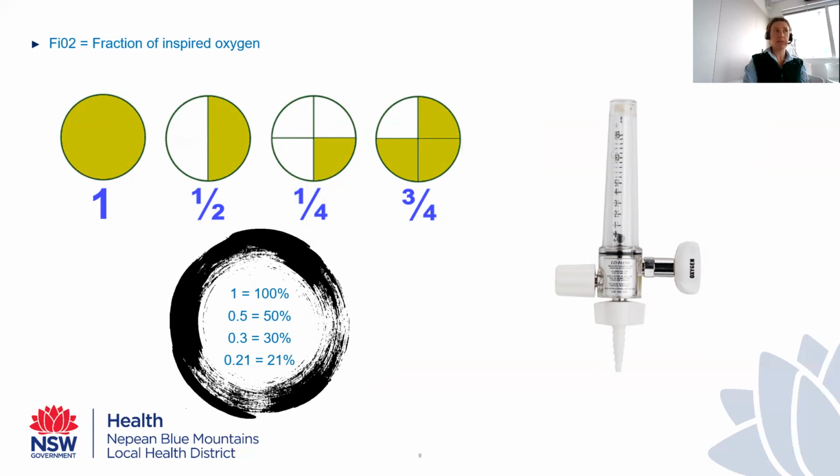In most ward areas, you would never normally titrate the pressures. That would be done either following a direct order by a medical officer, or the medical officer would do it themselves. In intensive care units and some specialist respiratory wards, the nursing staff may titrate pressures, but again, you need to follow your local facility guidelines or practices in regards to titrating both pressures and oxygen.